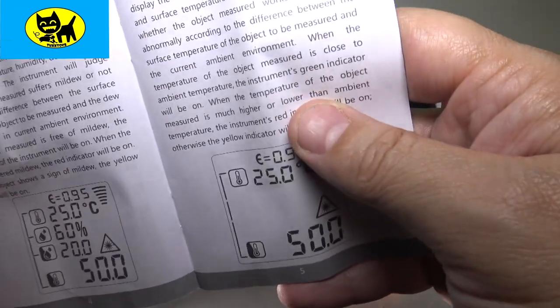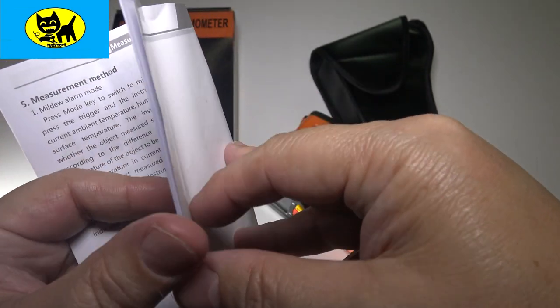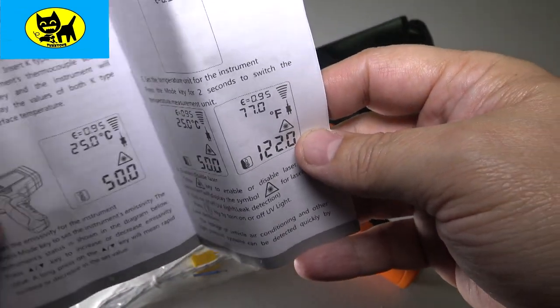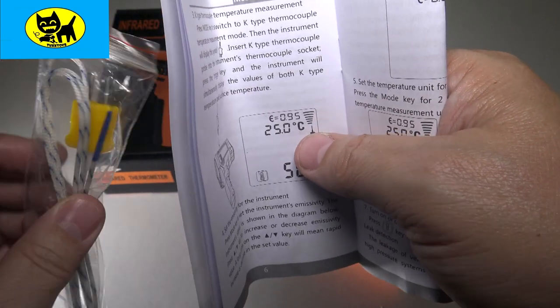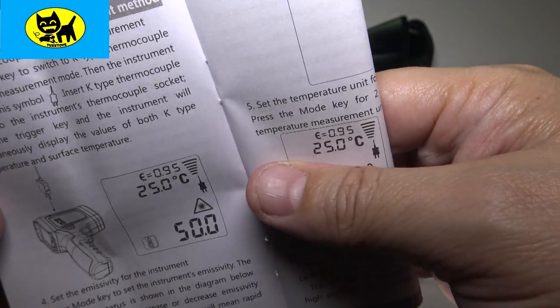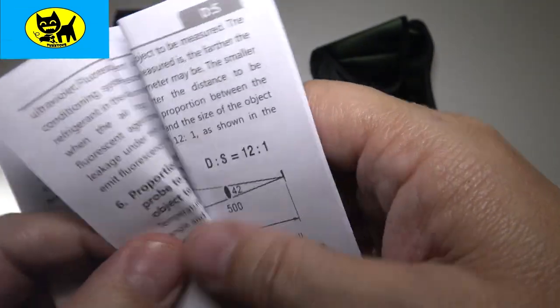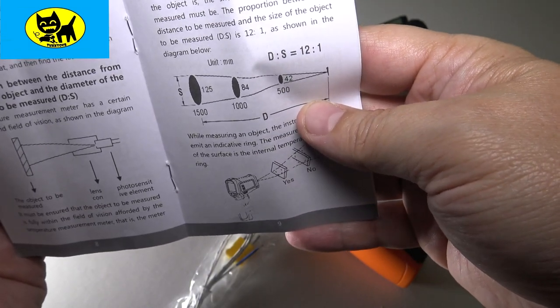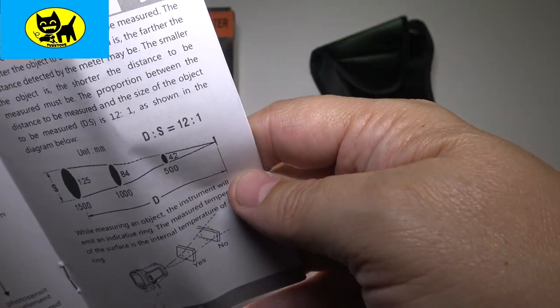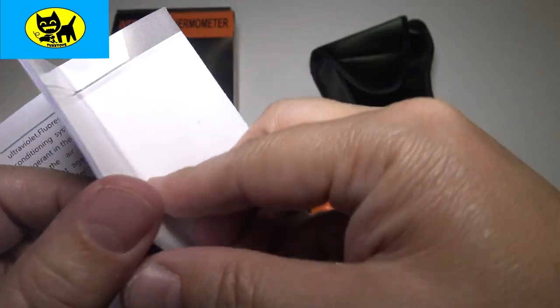Flipping through more of the manual, it covers Celsius settings and goes through each measurement type. There's a mildew alarm — you can set up a mildew alert, which I didn't even know this had. There's also information about the probe add-on: you can plug it out a window or into something hot. The manual talks about measurement distance and beam size, though it doesn't explicitly state maximum range — you need to be relatively close.